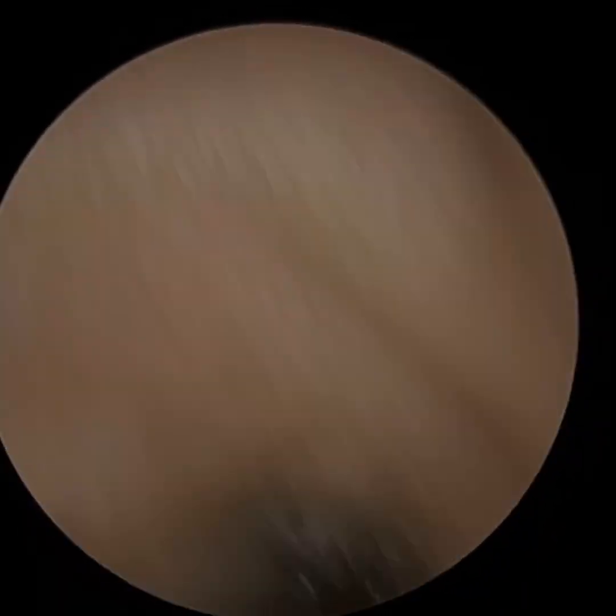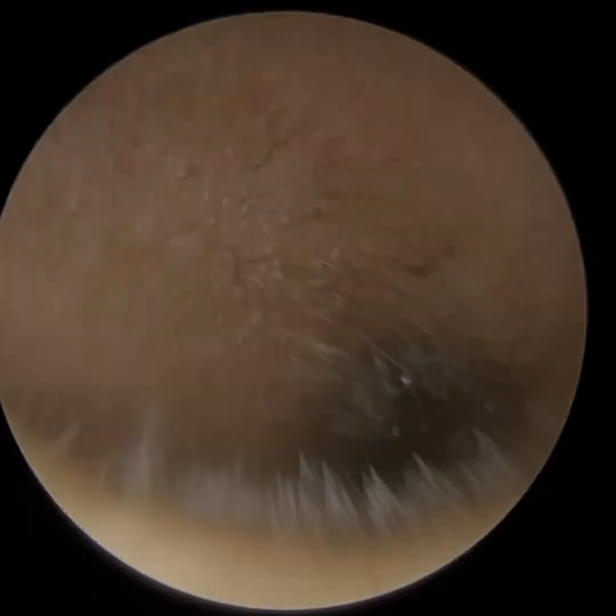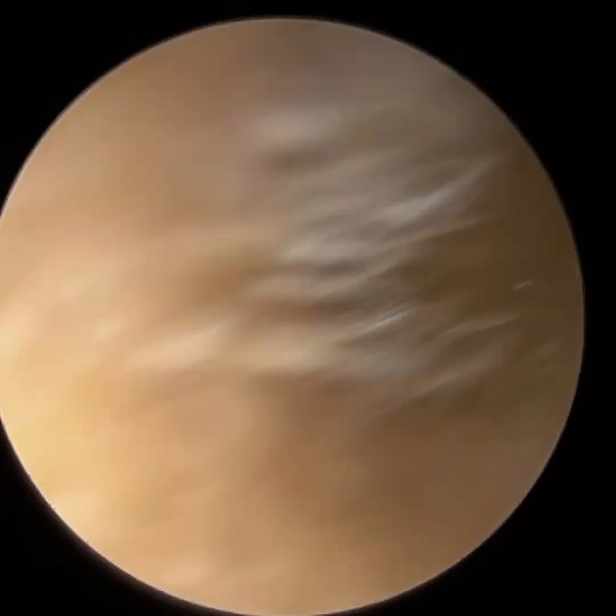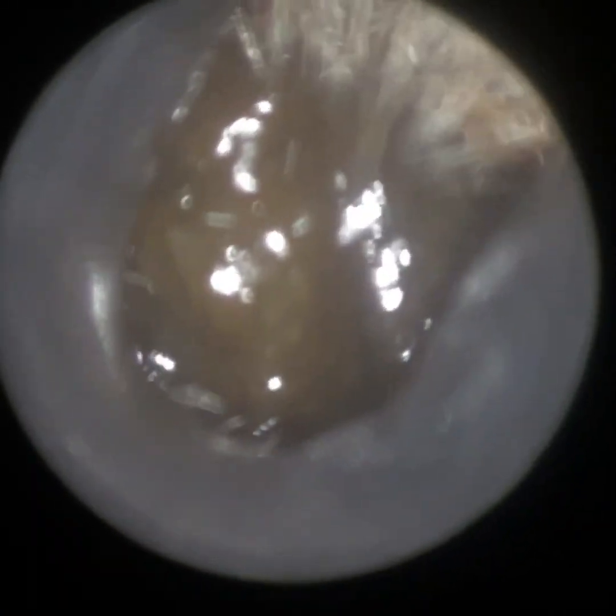Hi everyone, this is Mr Neil, writer to ear consultant, audiologist and director of Clearwax. Thank you for joining me in another demonstration video of our recently developed Waxscope, which is due to be launched in early December 2022.